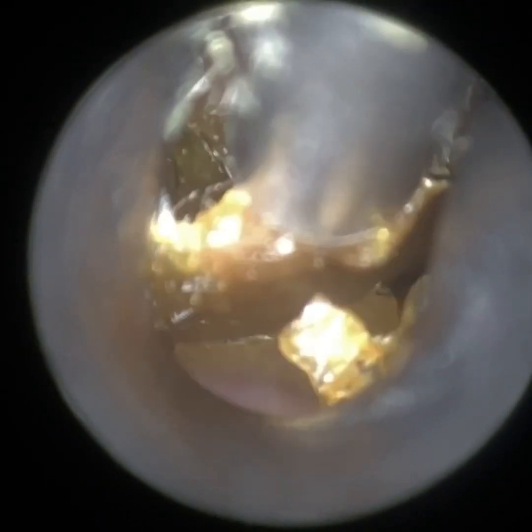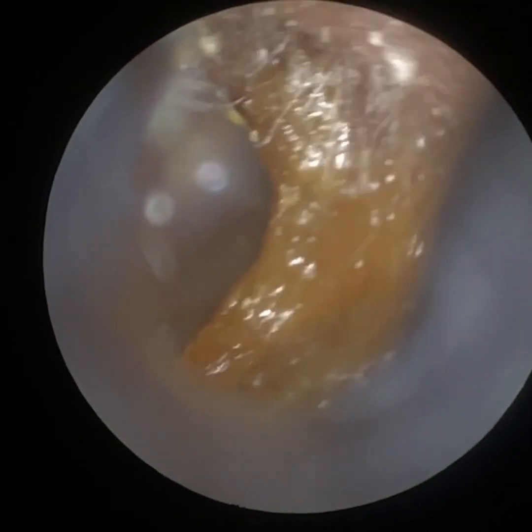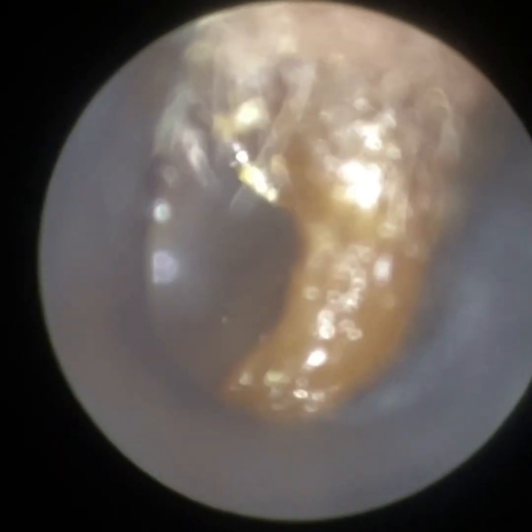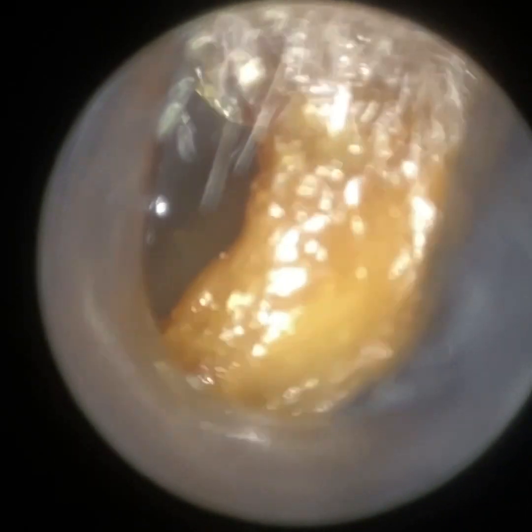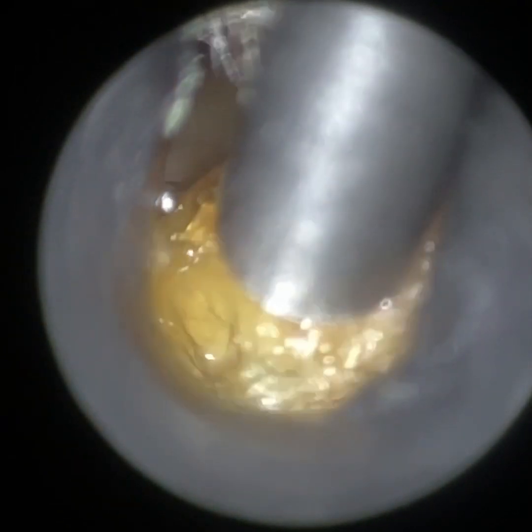They have also used loops before to remove wax, and as I said, the view with the Waxscope is just far superior. And of course, even with the iClearScope, it's even superior. So you can see how we've been clearing this here — using the 3.5 millimetre speculum, there's just some lateral wax and skin on the anterior canal wall, and I've just got it in focus.